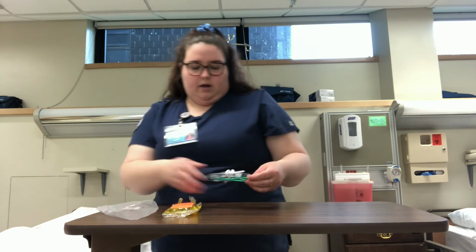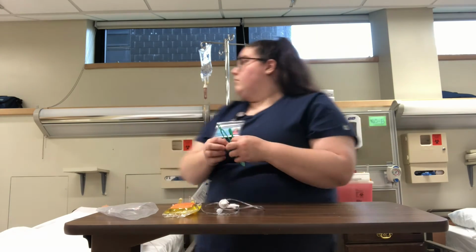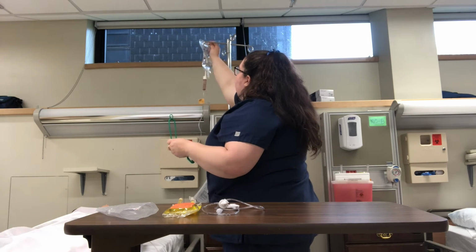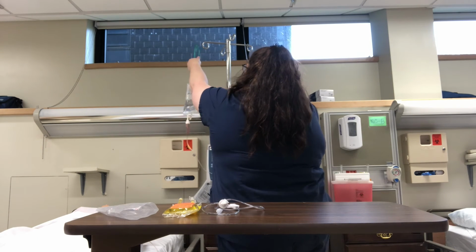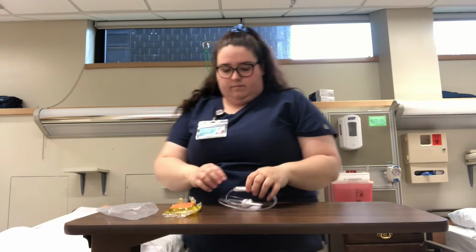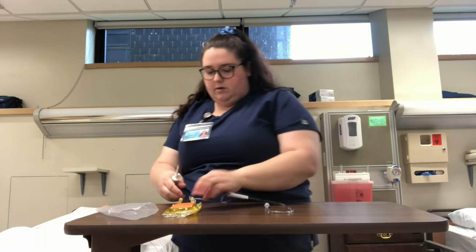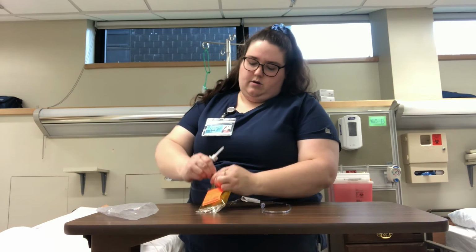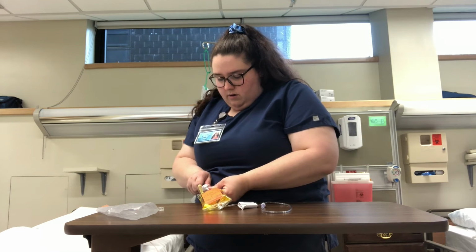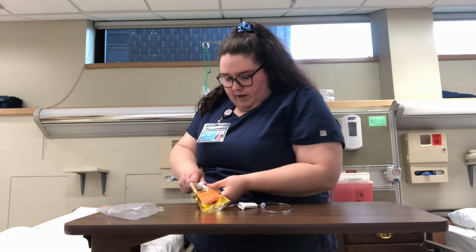I'm going to take my new tubing. I'm going to hang my primary line lower. I'm going to make sure that is clamped. Open that up. Spike the bag.